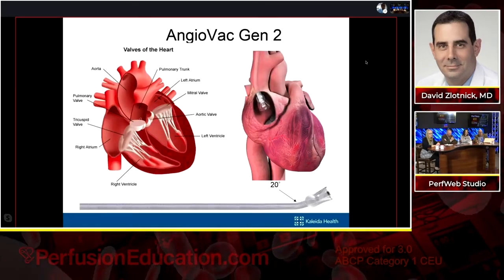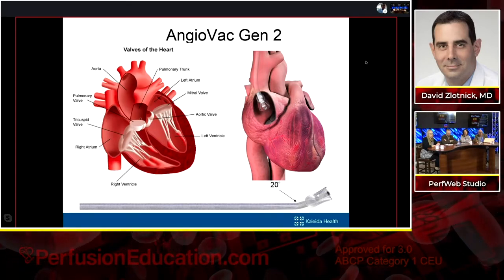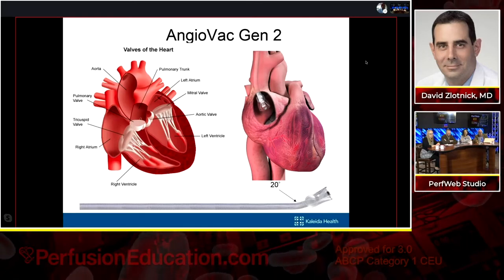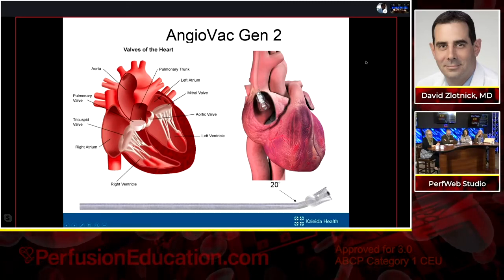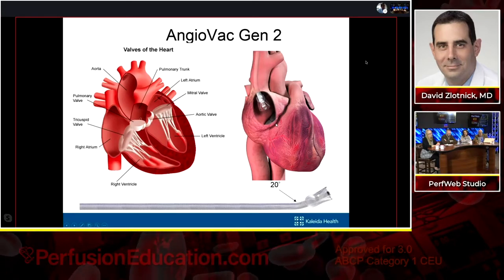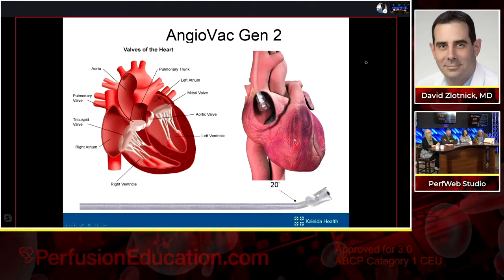Now, one of the things, this is with the second generation AngioVac device, and I think Mark kind of went over the design changes between AngioVac 2 and AngioVac Gen 3. But I just wanted to point out what we were working with, which was basically a 20-degree bend. Now, in this schematic, it looks like the 20-degree bend would be just enough to get us to the tricuspid valve. But in actual practice, that 20-degree bend gets us right into the IVC and not near the tricuspid valve.